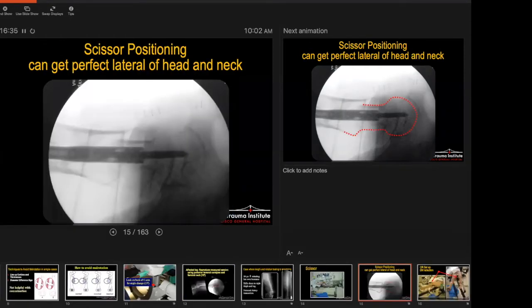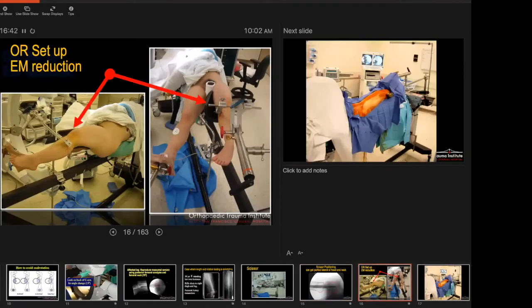This is the image you can get from scissoring position — there are no issues with getting a lateral view. I also like to use extramedullary reduction techniques. Some people will use a crutch, but I don't like it because it goes all the way down to the floor and creates a problem for the C-arm. Instead, you can take an arm positioner, attach it to the table, and lift up to hold the fragments in the right position.